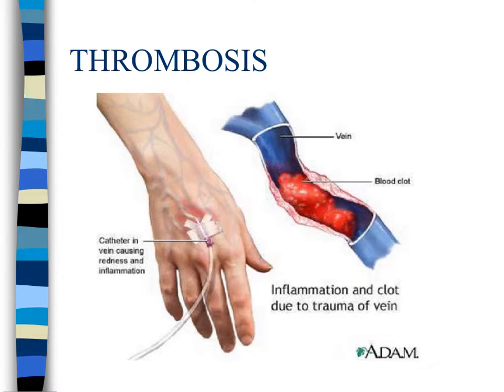Nursing interventions include removing the device and restarting the IV and infusion in the opposite limb if possible, applying warm soaks, watching for IV therapy-related infections. Never force flush a catheter to remove an occlusion. Rather, you discontinue the catheter, restart the IV infusion with a new catheter at a new site, and apply a dry, sterile 2x2 gauze dressing over the previous site. We also would notify the physician and assess for circulatory impairment.